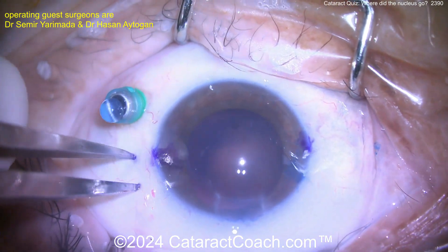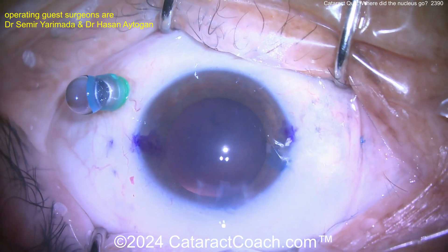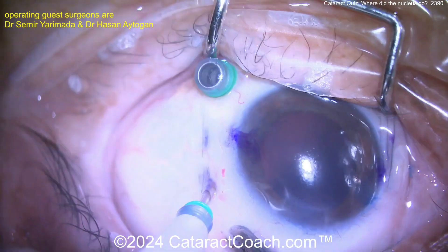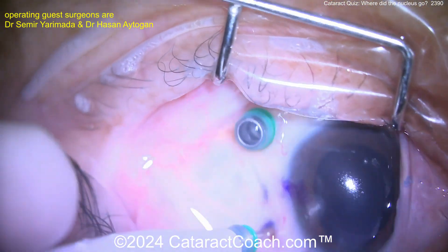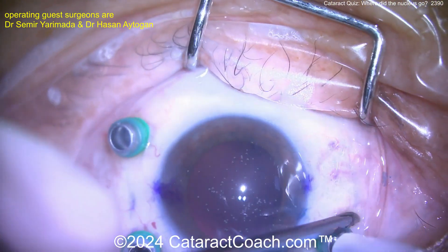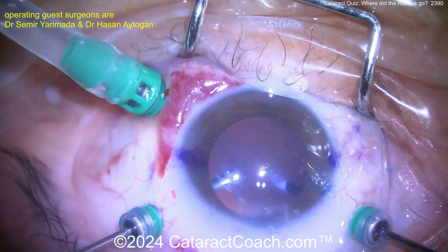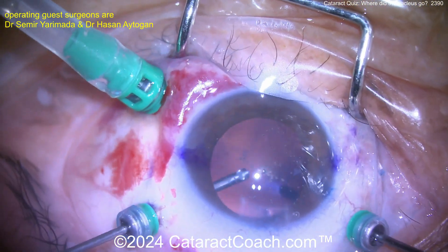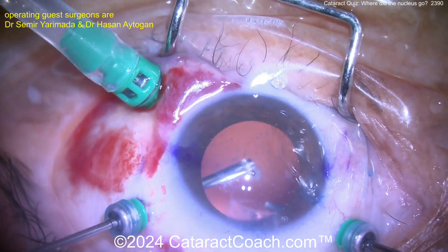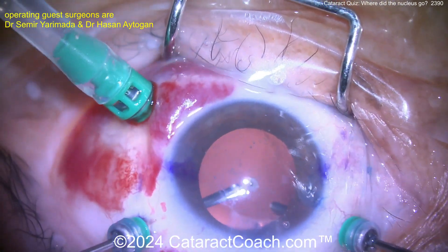Let's look in the back with a viewing system just to make sure there's nothing going on back there. Here's a three-port pars plana vitrectomy going inside to clean up any of that vitreous. With the viewing system, let's look back there and make sure there is no lens material in the vitreous cavity.